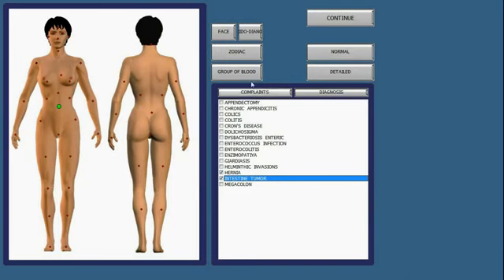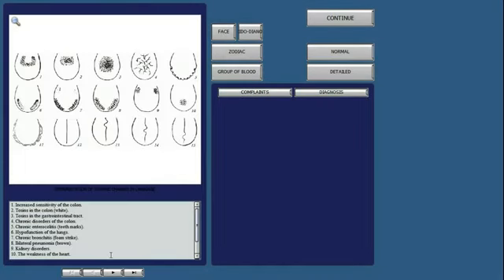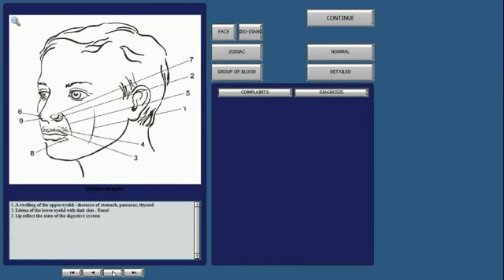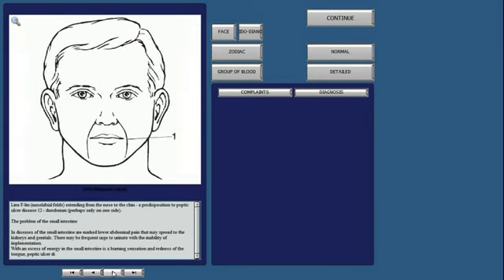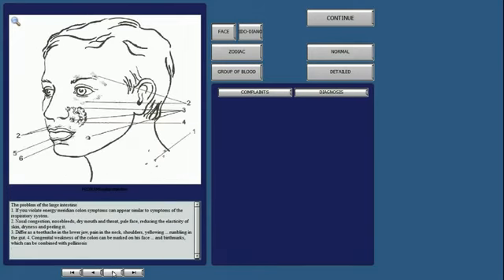Now, these other features here, the face feature, as I call it, is very helpful if you have your patient in front of you, which I would always recommend, having your patient sitting in front of you and you looking at your screen alone until the scan begins. That way you can examine them and look at their tongue, at their face, into the eyes, and see maybe if you have any clues with this helpful face feature here to which and where their problems could be.